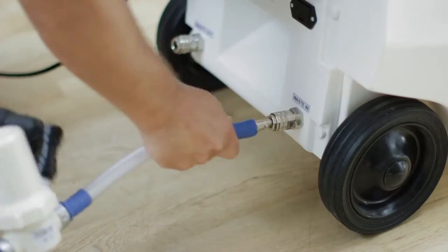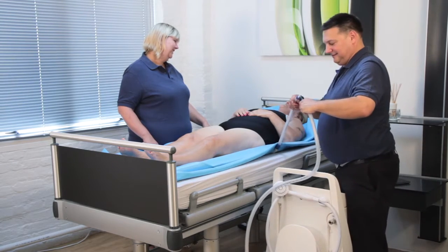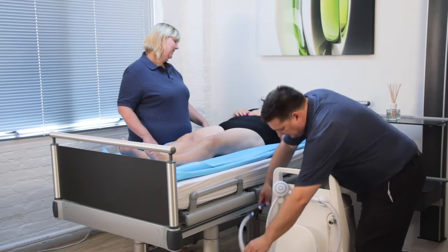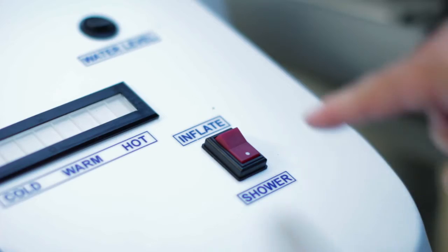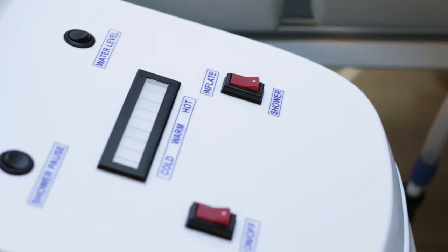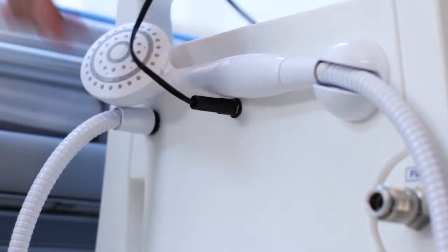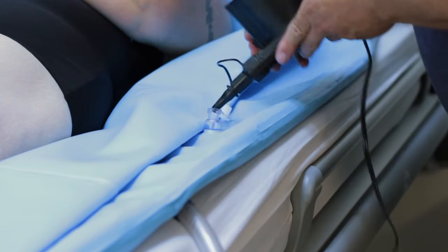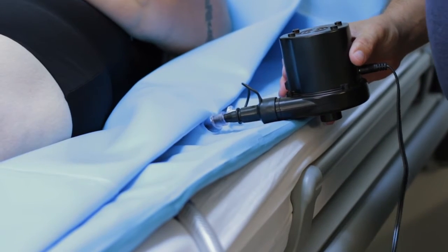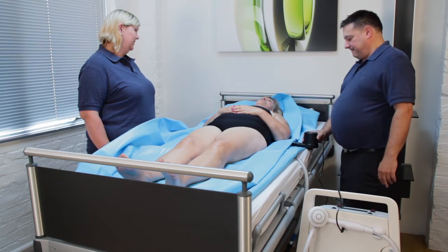Fit the waste in hose, which has a cream coloured filter. Ensure the arrow on the top of the filter is pointing to the Watergenie socket. Set the switch on the right hand side of the Watergenie to inflate. Plug in the inflator at the rear of the Watergenie. Place the nozzle of the inflator into the lower of the two inflation valves on the bath.